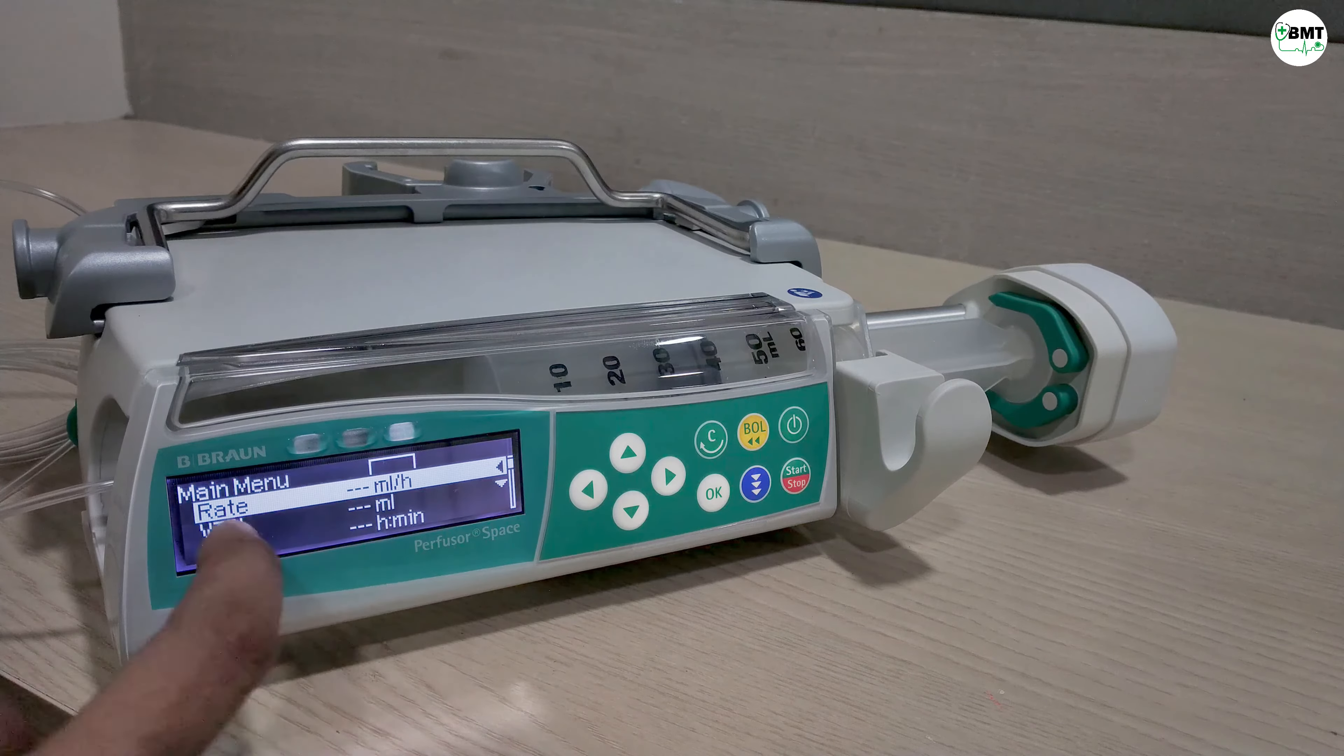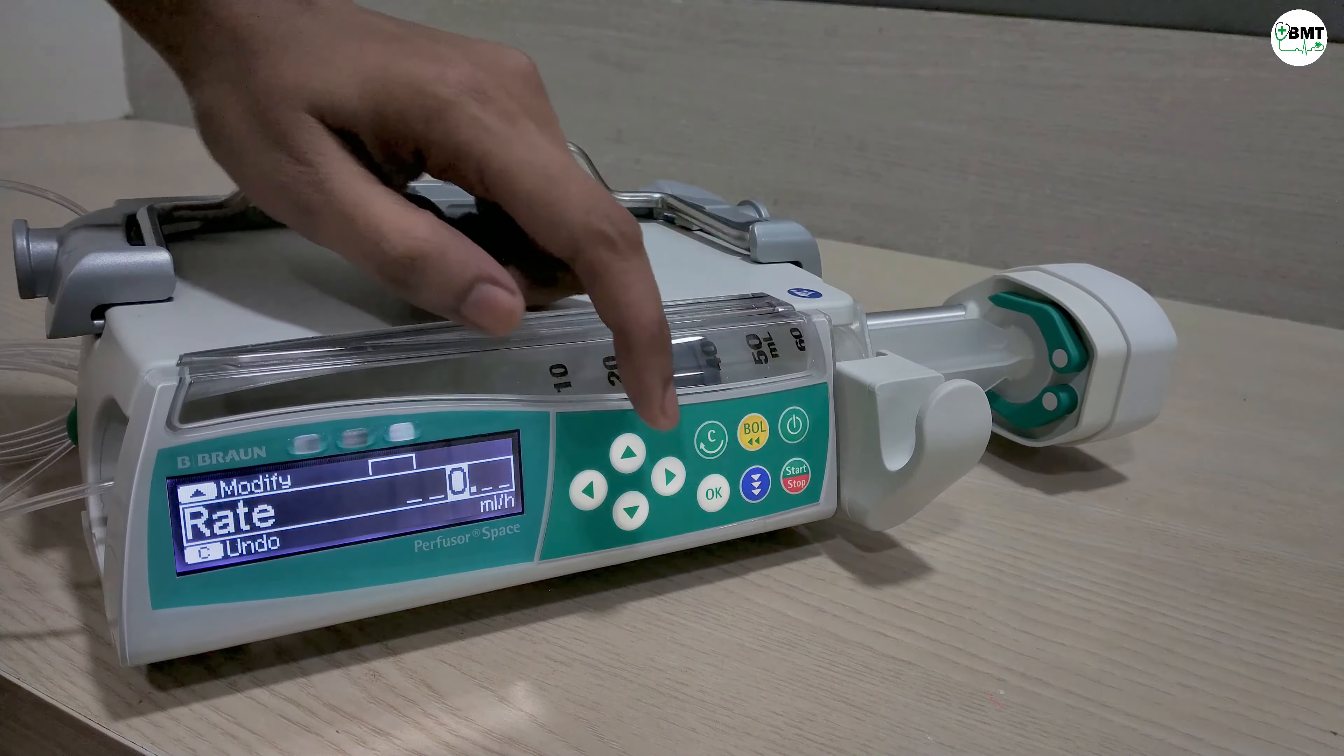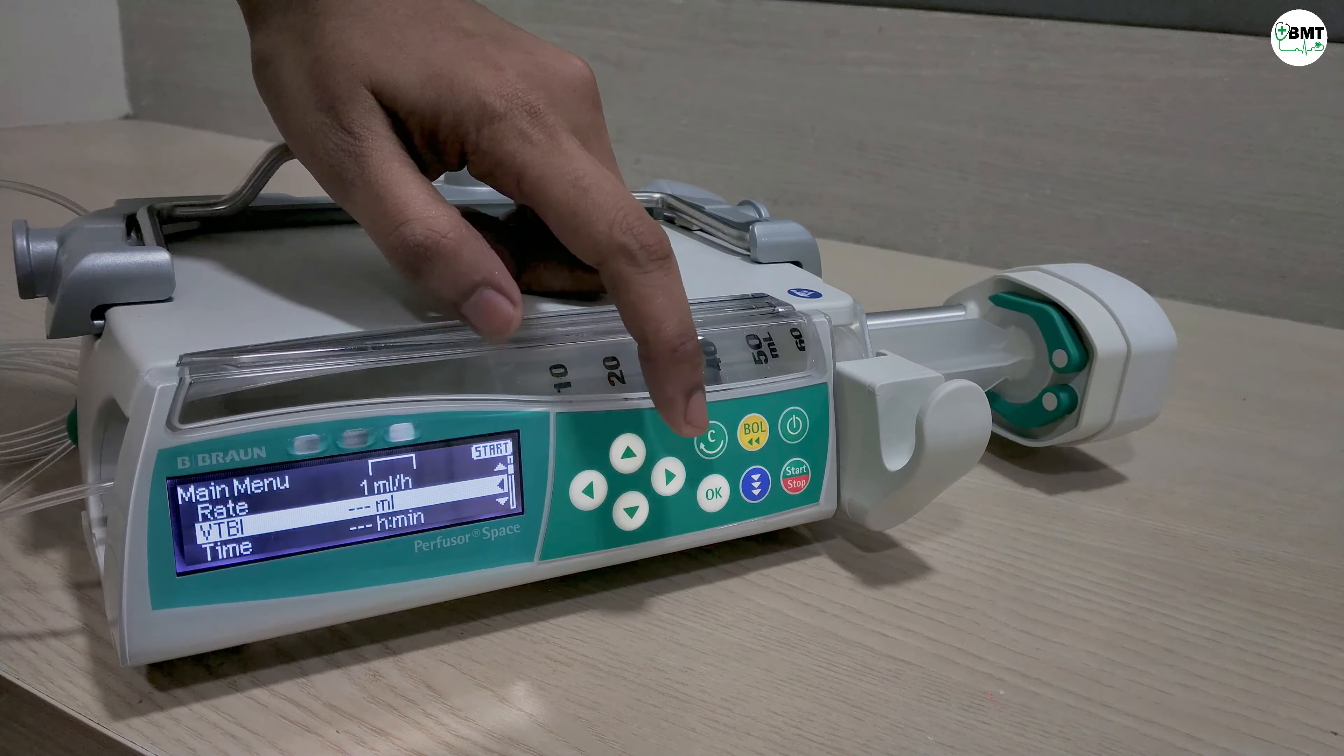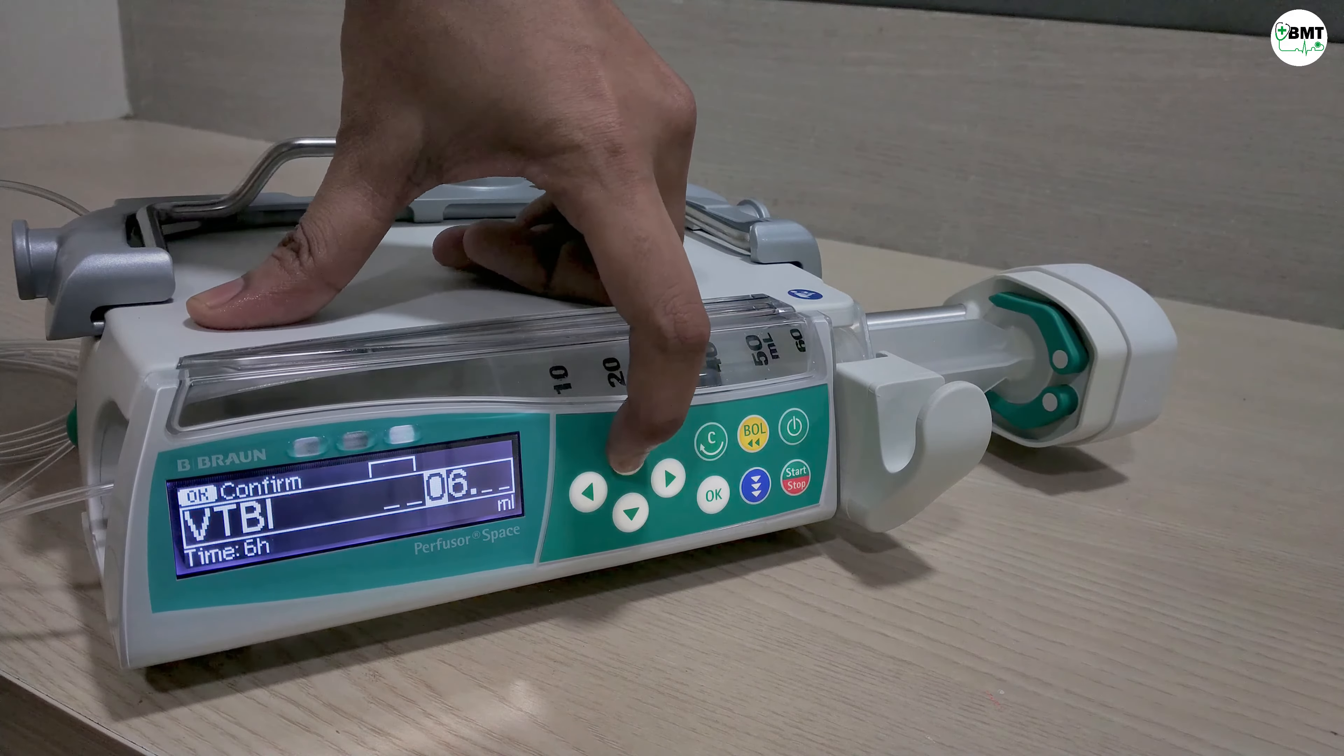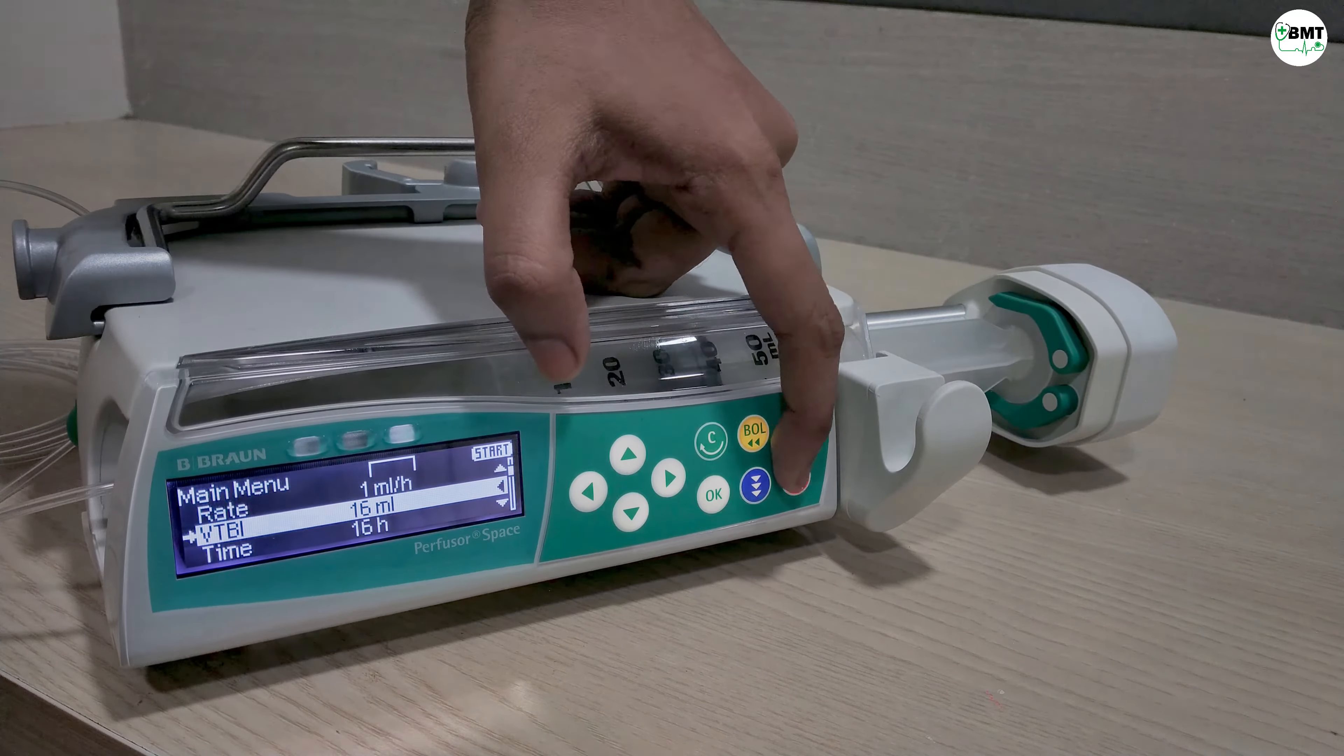Now set the rate. Increase, decrease. Once rate is set press OK. Then select the volume to be infused. OK, increase, decrease, OK. Then accordingly time will automatically get adjusted. Once set press start.